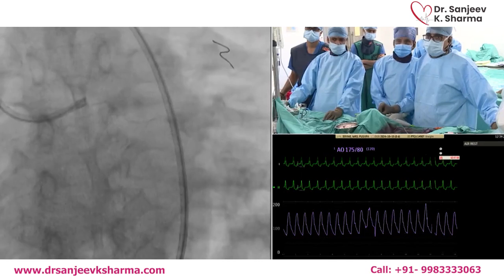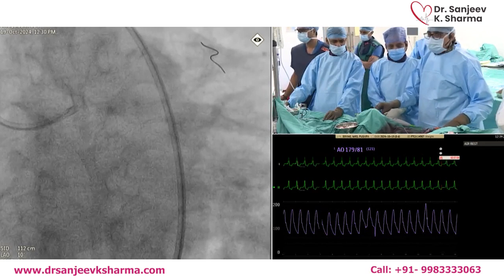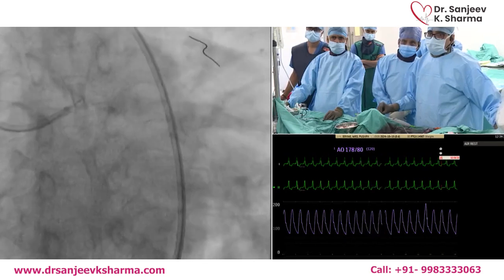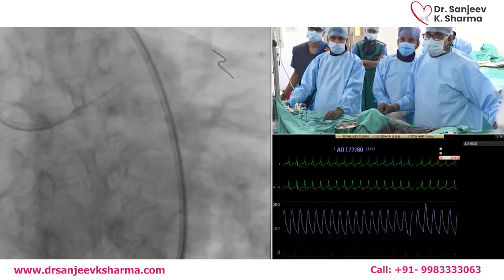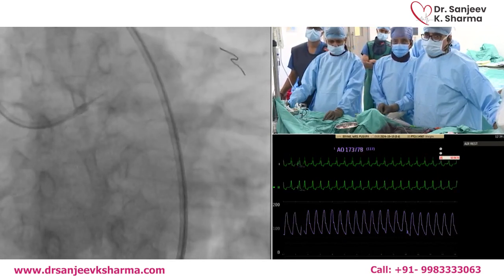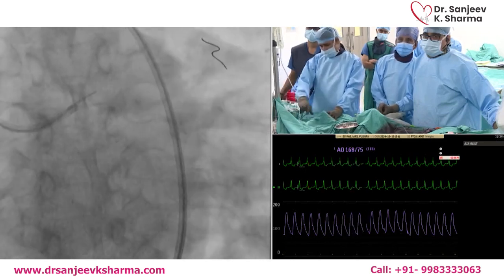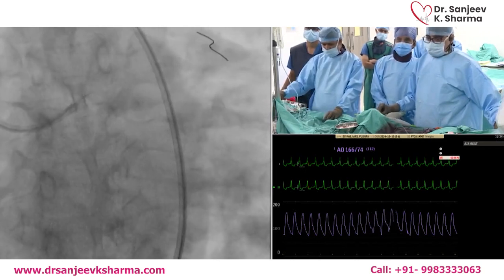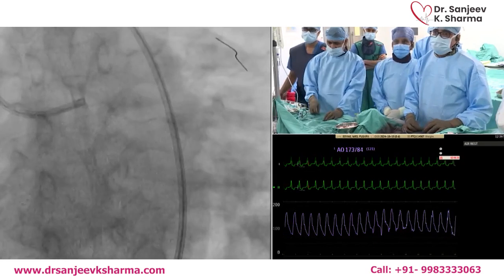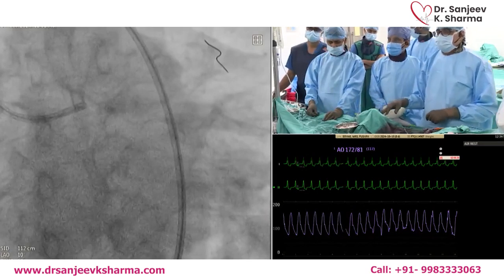One more comment. Dr. Sharma, this is Atul Mathur. Broadly, in your routine practice, how do you split your calcified lesions between IVL, rota, and orbital atherectomy? I will show our data once my time comes. But just to say, we do a lot of workshops. We do about 65 atherectomies per month. Of the 65, 55 will be rotational, 8 will be orbital, and 3 will be laser. And about one third of the time it will be combined with IVL.